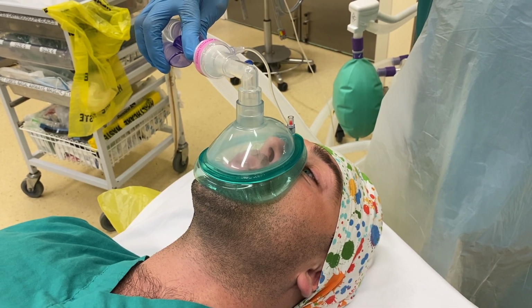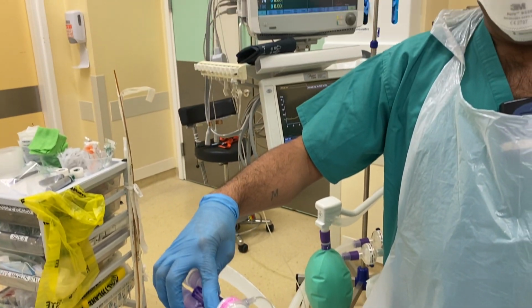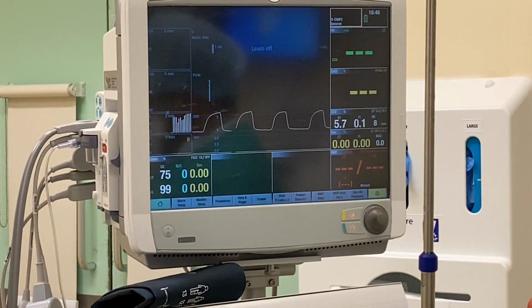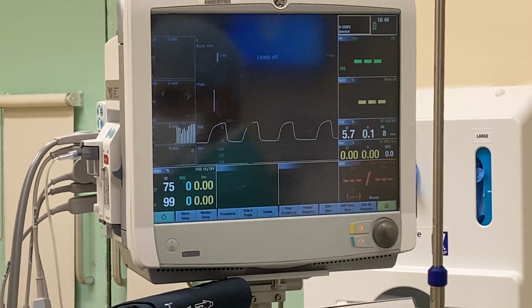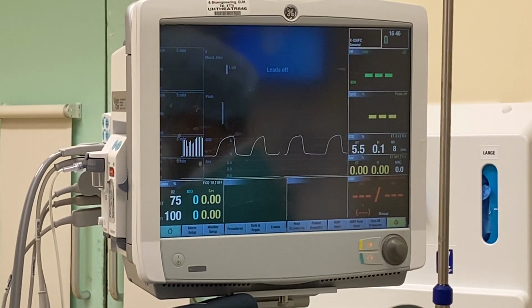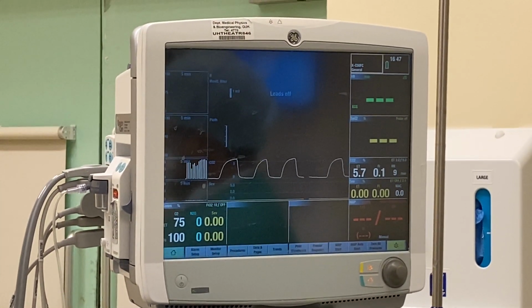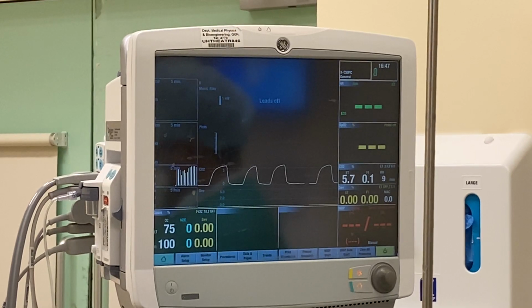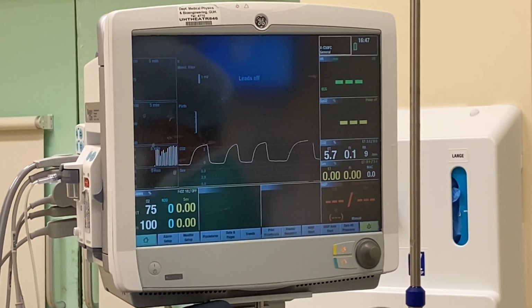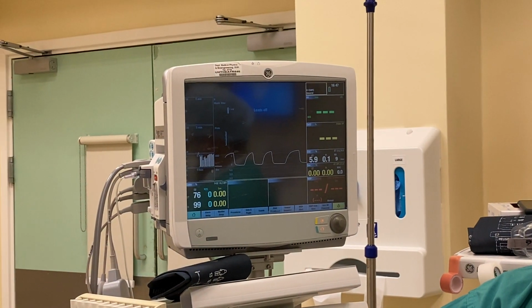So this tells you that you've got a good seal. Another way that you can tell that you've got a good seal and that he's breathing in all that oxygen is that on all of our monitors we have end-tidal CO2 monitoring, and that's that white line that you can see there. Each time Irla breathes out, he of course breathes out carbon dioxide, and each time he breathes in, no carbon dioxide. So it drops back to 0 as he breathes in, and as he breathes out, our CO2 rises again. You can see the number on the side, it's up in the 5.7 there now. So that's how Kumar can tell that he's got a good seal on Irla's face.